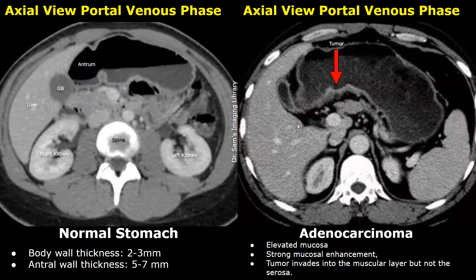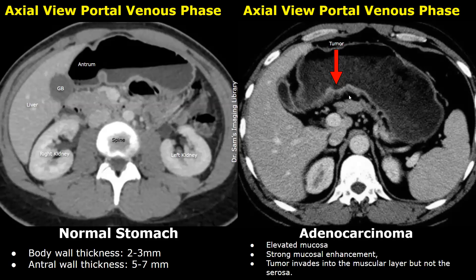This is another case of adenocarcinoma. There is an increased wall thickness and the thickened area shows strong enhancement. An abnormally increased wall thickness can suggest tumor invasion into the muscular layer. However, the outside fat tissues appear normal, meaning the outermost layer — the serosa — is not involved. This dark hypodense area outside the stomach is perigastric fat tissue. Normally it appears dark gray or hypodense, but if the tumor invades the fat tissue there will be increased density, called fat stranding or infiltration of the tumor into the perigastric fat tissue.